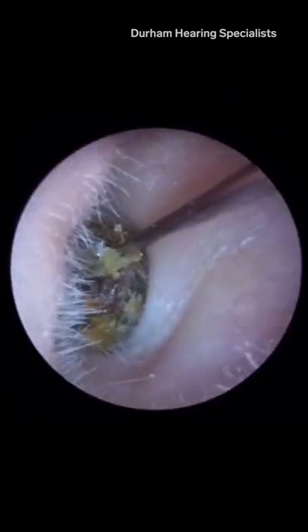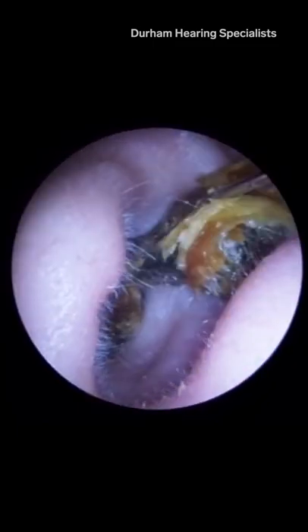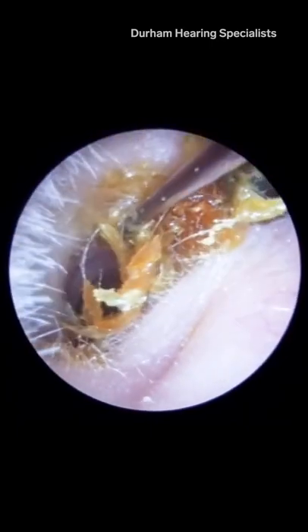And that is excruciatingly painful. When we see an impacted plug like this, there's usually sheets and sheets of dead skin enveloping it, sort of like lasagna, basically.